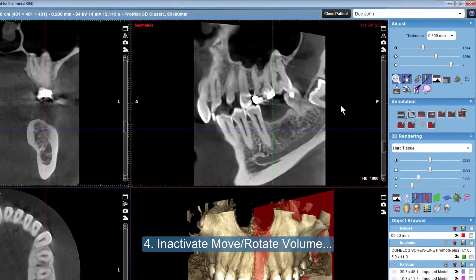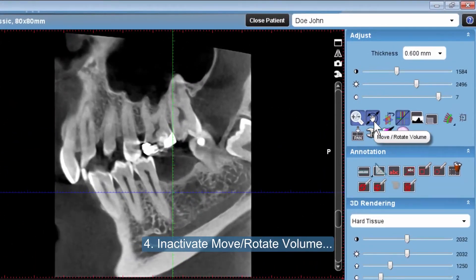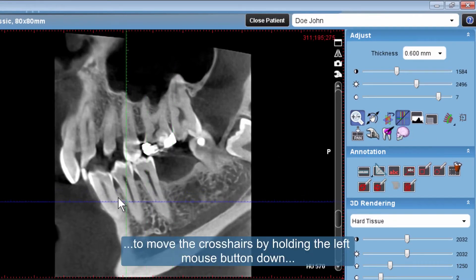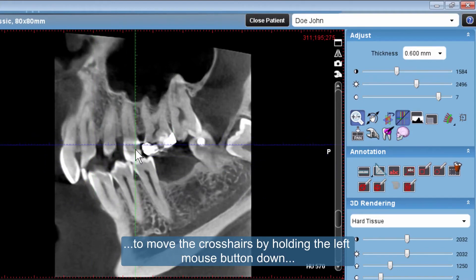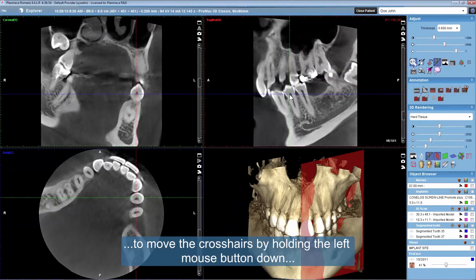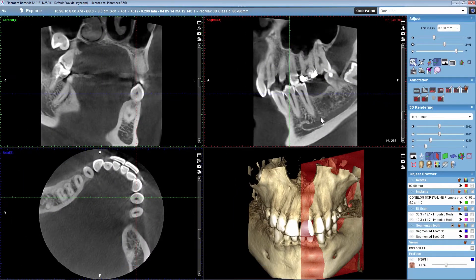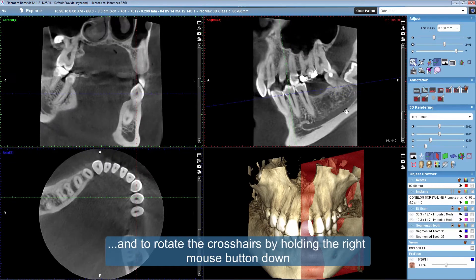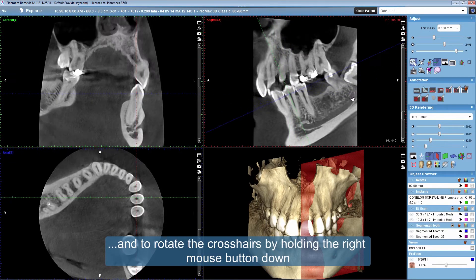Inactivate move or rotate volume to move the crosshairs by holding the left mouse button down, and to rotate the crosshairs by holding the right mouse button down.